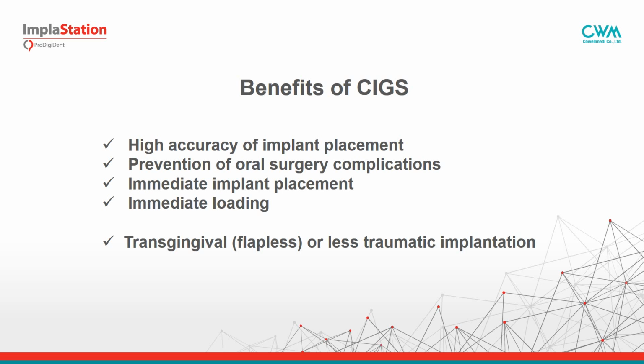Just let me draw your attention to the benefits of using surgical guides in practice. First of all, of course, it's a prevention of oral surgery complications due to the high accuracy of implant placement. Also, using surgical guides, you can use immediate loading and immediate placement protocols.